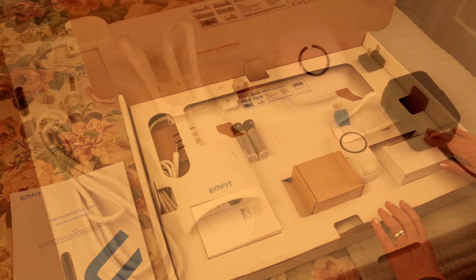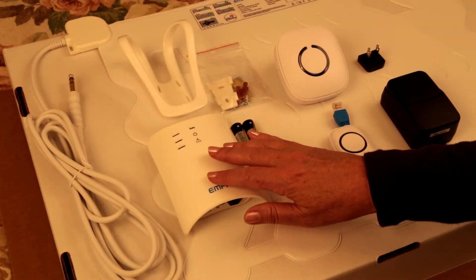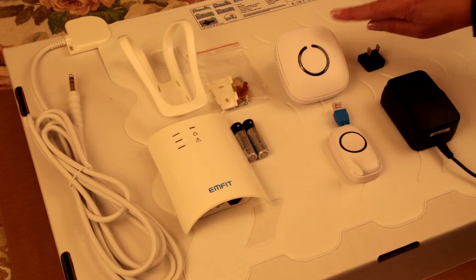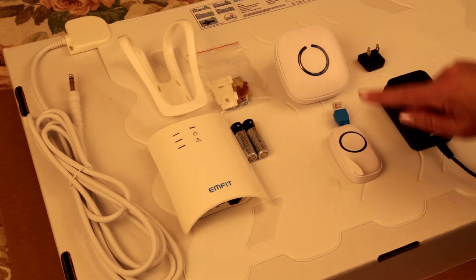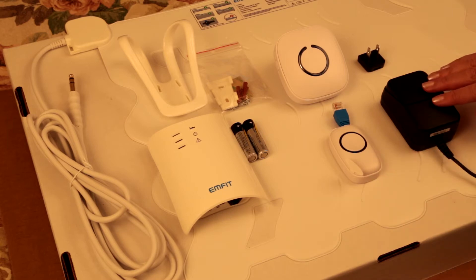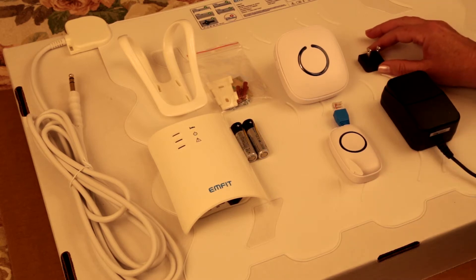A typical setup will include the Mfit control unit, mounting bracket, two AA alkaline batteries, the optional remote alarm and transmitter, the optional medical grade AC adapter and plug-in blade, and the Mfit bed sensor.